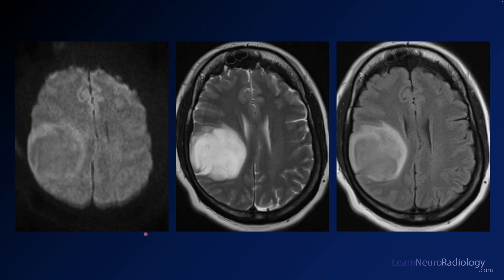Here you see the images from this case. On diffusion, there's maybe a faint rim where it's bright, but bright diffusion is not a dominant feature here. It's very bright on T2 with a relatively well-delineated margin. Then on FLAIR, you again see well-delineated margins, but the central portion of the tumor is more suppressed on FLAIR compared to T2.